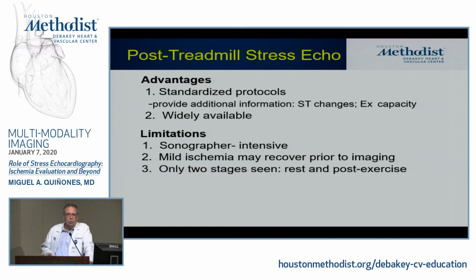We use a standardized protocol for exercise, usually the Bruce protocol. Most people have a treadmill in their office and an echo machine, so it's widely available and easy to do, but it's actually the most difficult. From the point of view of the technical components of a stress echo, the stress on the sonographer is the greatest with the treadmill, because number one, you're trying to image very quickly after the patient comes out of the treadmill, and second, you're trying to reproduce the same tomographic planes that you got at rest.